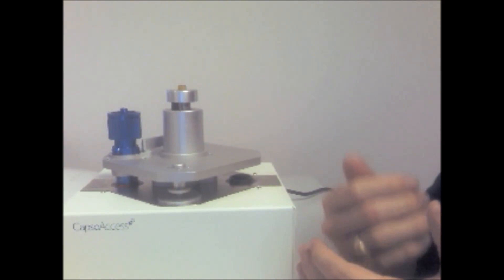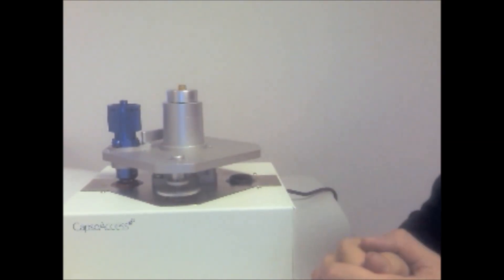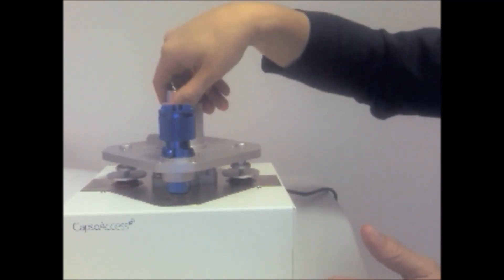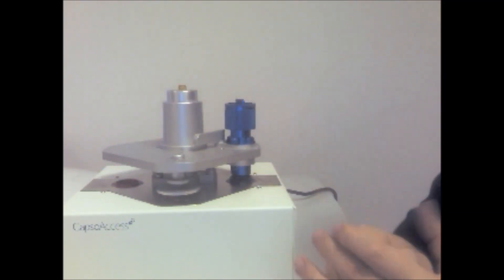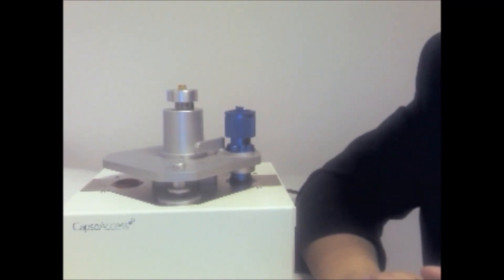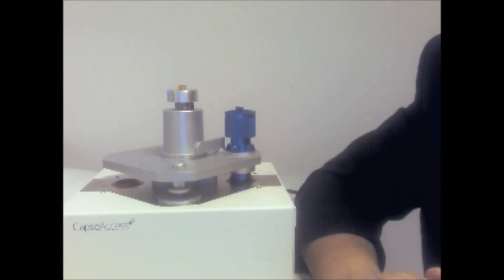Once that's done, you're ready to proceed to the download. So lift the unit by pressing the middle switch, rotate 180 degrees anti-clockwise, and this is where the unit does the download. Lock in place and then click onto the second option just underneath the alignment button within the software and enter the patient data.